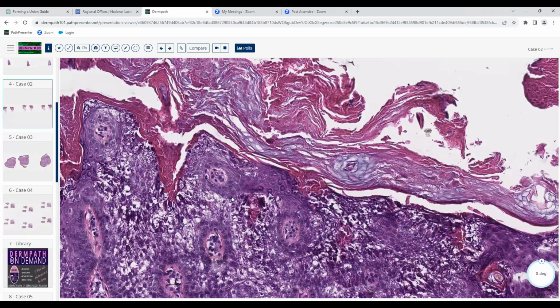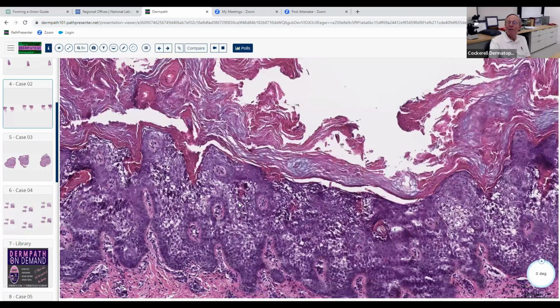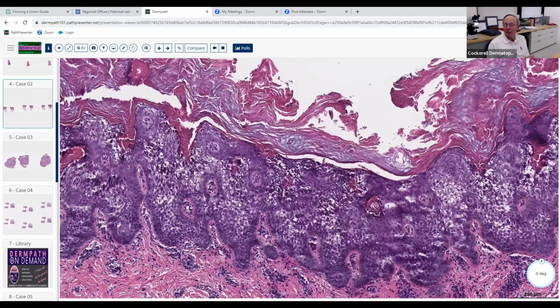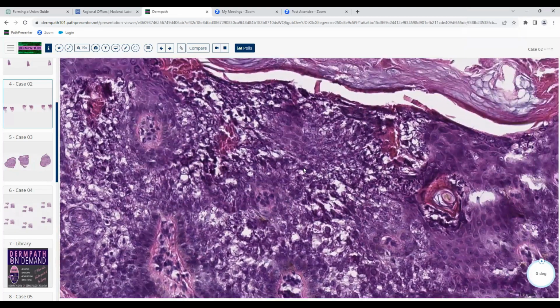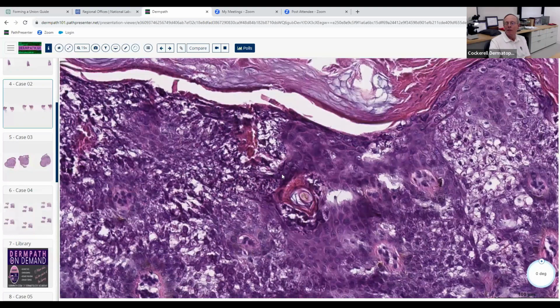Hyperkeratotic. Okay, sure. Reaction pattern is called epidermolytic hyperkeratosis. Now, I don't like that garbage term that they used in that case report, epidermolytic ichthyosis or whatever they're trying to call it now. I like the good old fashioned epidermolytic hyperkeratosis reaction pattern. So this is what this is right here. Oh, okay. So fantastic example of this.